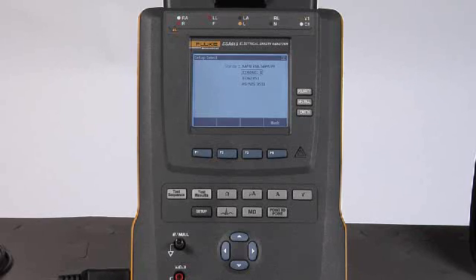So there you have it — the ESA615 Automated Electrical Safety Analyzer from Fluke Biomedical.